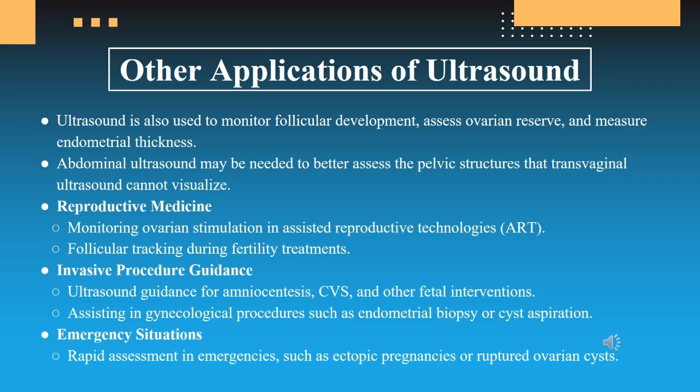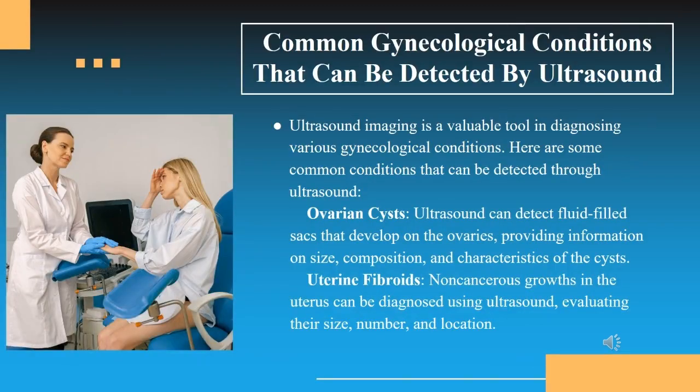It helps assist in gynecological procedures such as endometrial biopsy or cyst aspirations. And in emergency situations, for rapid assessment such as ectopic pregnancies or ruptured ovarian cysts and ovarian torsion, it can diagnose immediately.